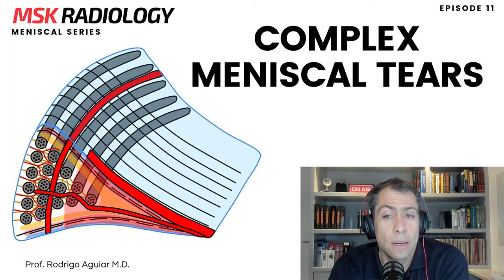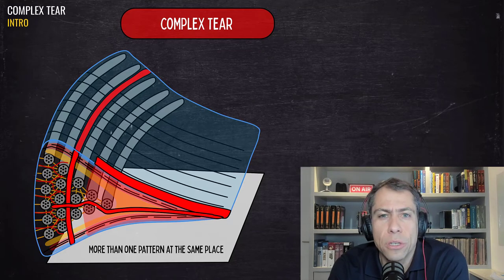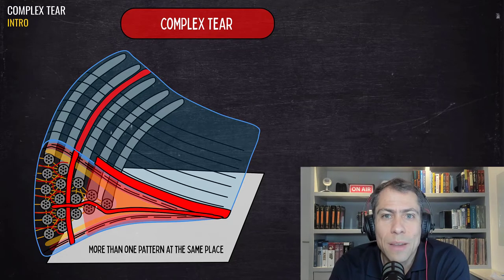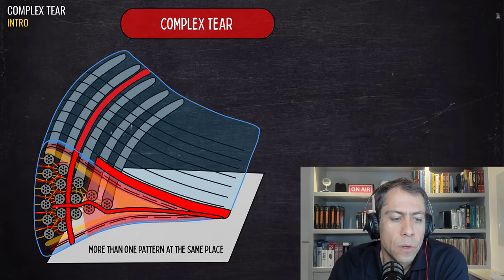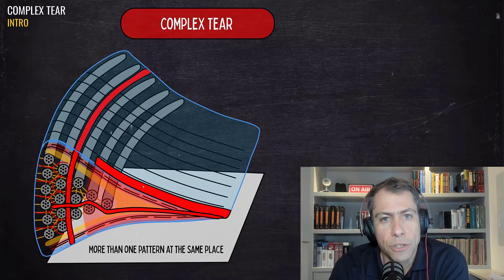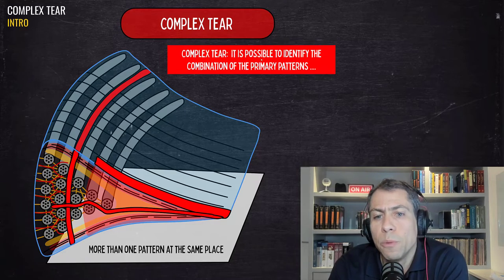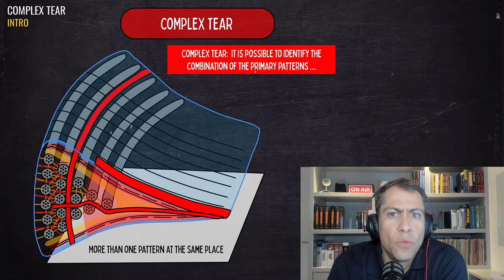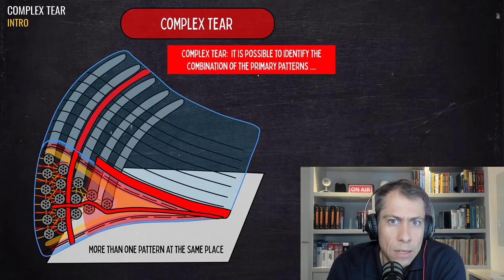In this video let's talk about another type of meniscal tear: the complex meniscal tear. The complex meniscal tear is a combination of different patterns of meniscal tears at the same meniscal region. For example, in this picture we can see three different patterns at the same meniscal region: horizontal type, vertical longitudinal type, and a partial radial type. In complex tears, it's possible to identify the combination of different primary patterns of meniscal tears.